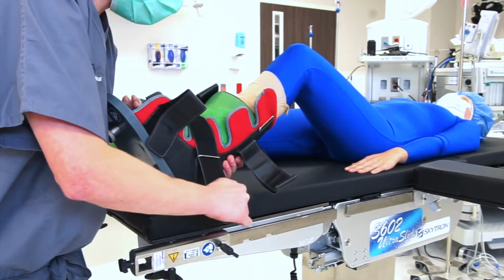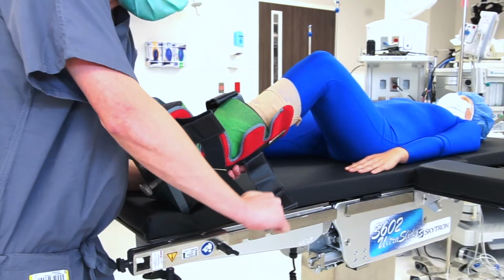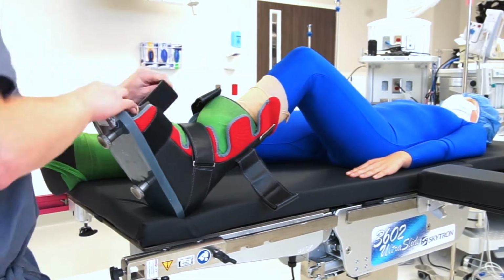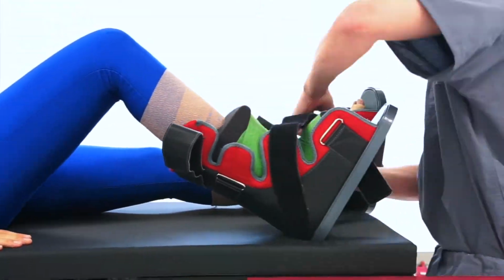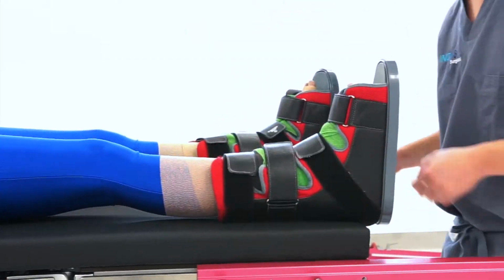To tighten the strap, pull down firmly, then lay the strap back over itself to secure the Velcro. There is no need to pull up firmly on the strap, as this could damage the boot. After the ankle strap is attached, fix all remaining straps the same way. Repeat this process for the other foot. Ensure both feet are prepared similarly and all straps are tight.